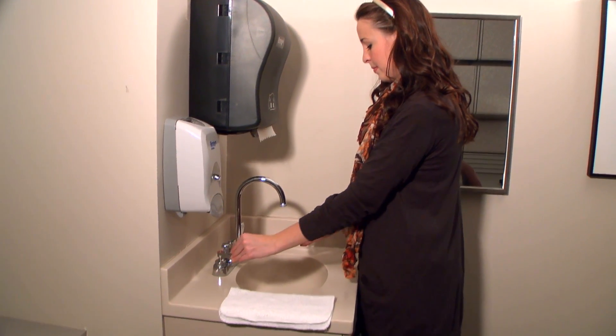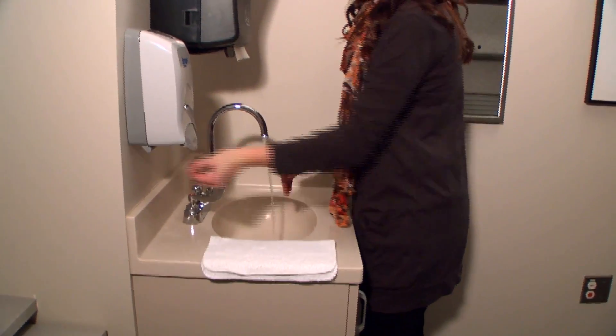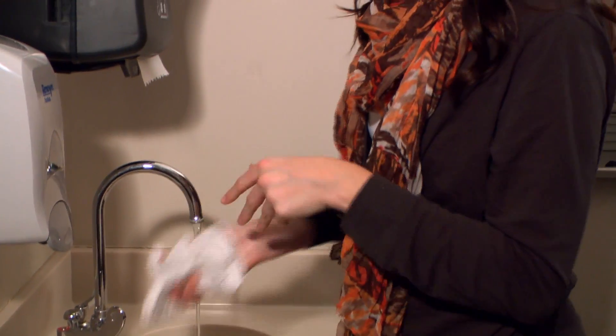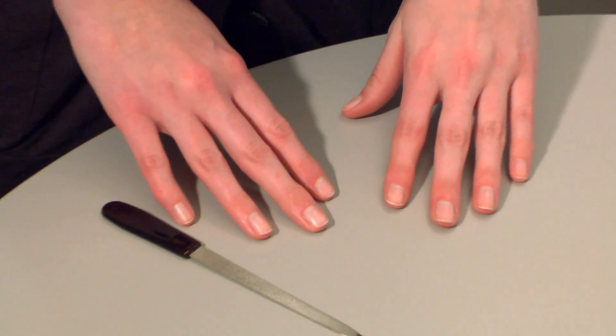Before you handle your contact lenses, it's always important to have good hand hygiene. Wash your hands thoroughly with a mild soap that doesn't contain moisturizers and dry them completely with a clean, lint-free towel. Also, keep fingernails short, filed and clean.